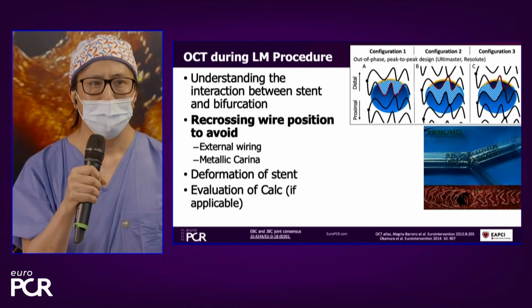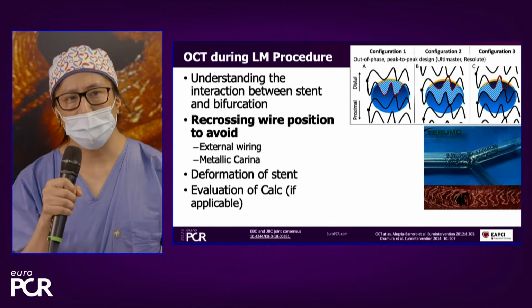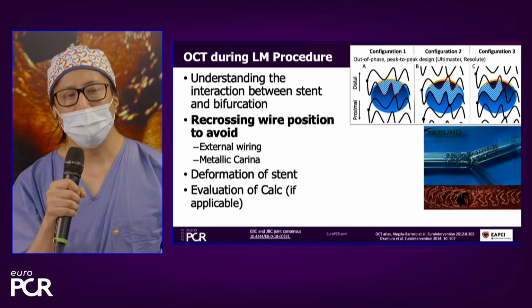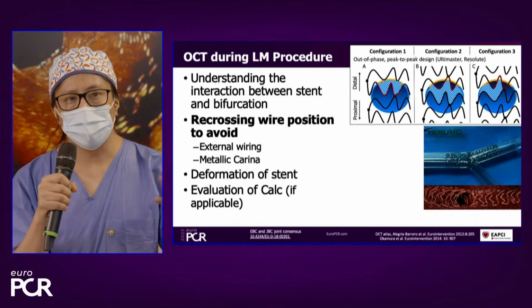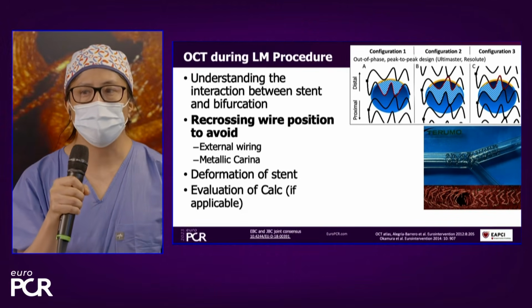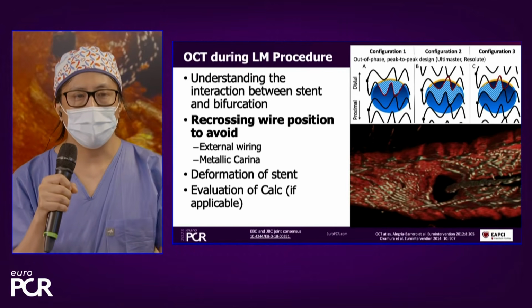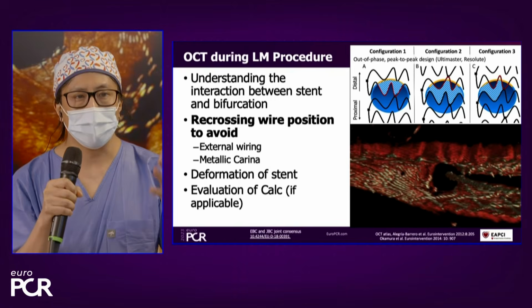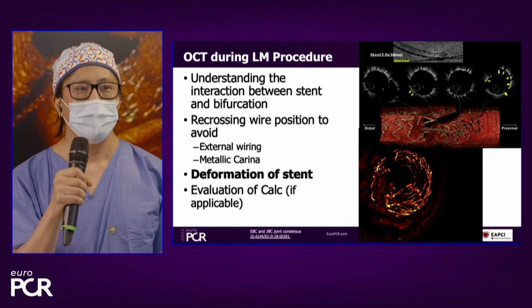Go next, please. This is a phantom of the Nagomi. We just try to look at the opening of the side branch. I think the live case, the last 3D, looks a little bit like the same pictures. So yeah, in human, if you have a 3D reconstruction, you can really assess the opening of the side branch.